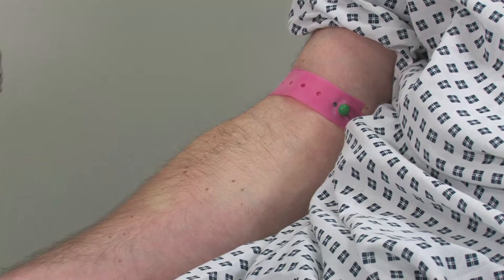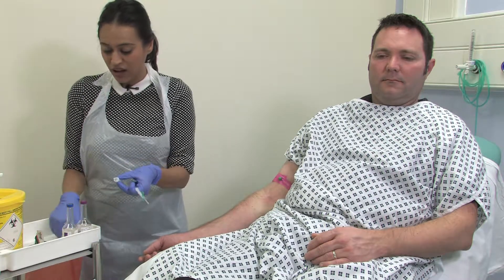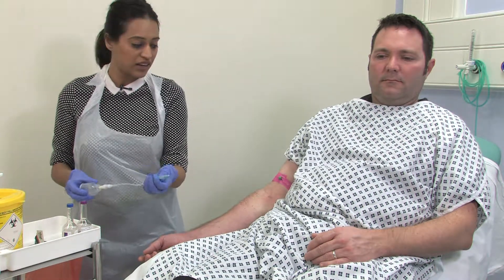Whilst the skin dries, it's important that we set up our butterfly set with our adapter cap. We're now ready to collect our blood cultures.